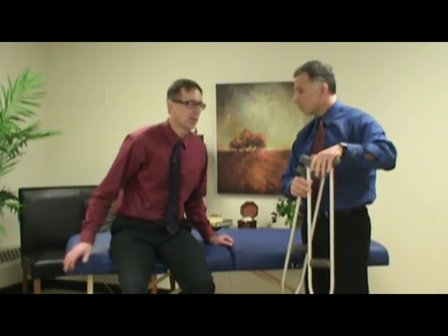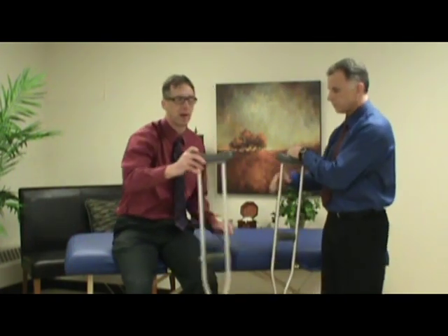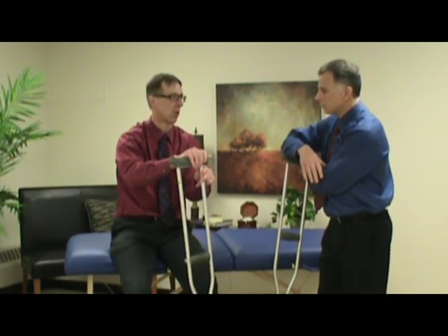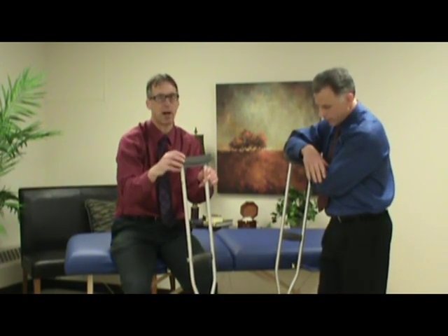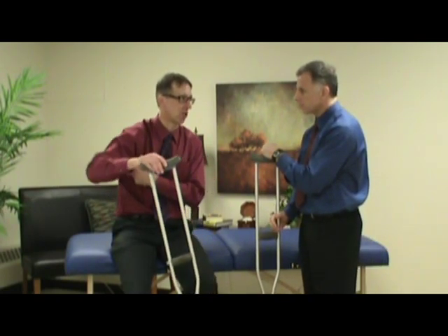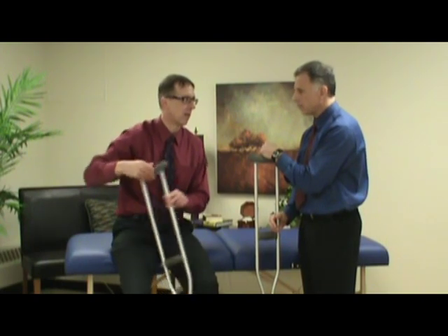These things, they do come off if you need to clean them. I have seen some people also, if they get rubbing underneath the arm, take lamb's wool and put it on top of this, and even tape it on, because they get sore under the armpits, even though it's not jamming up in the armpit, just from the fact that they're using it all day long.